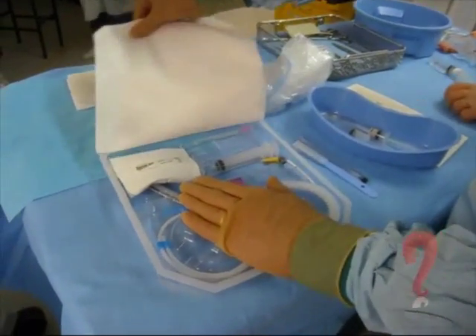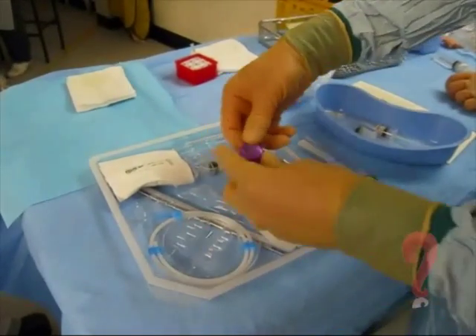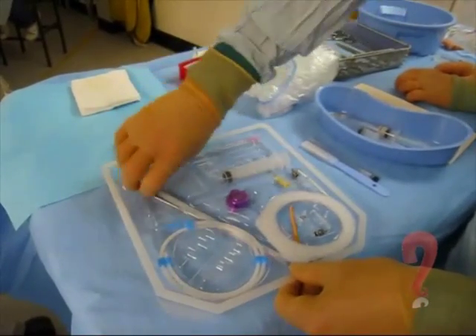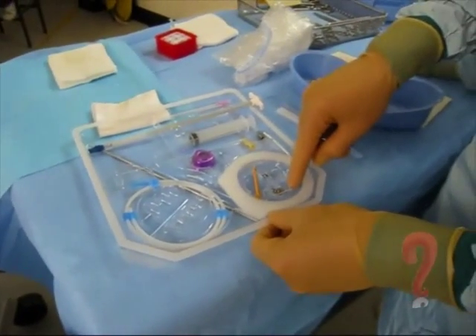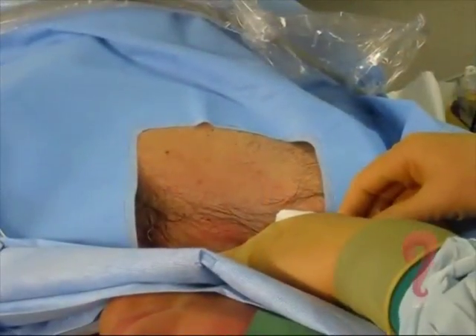This is the power port kit, which contains most of the things — in fact all the things you'll need for insertion. There's the port itself, peel-away sheath, metal tunneller, guide wire, angled needle for injection, syringe, and seldinger needle. So this will be a bit sharp.